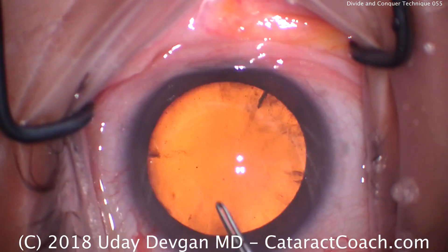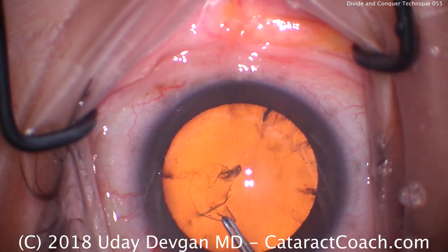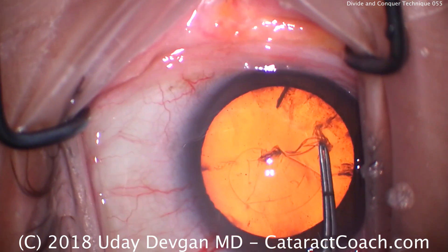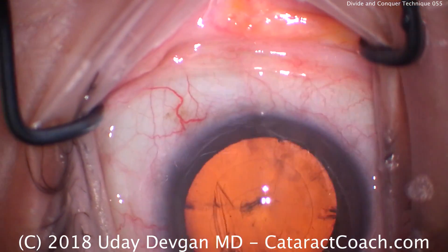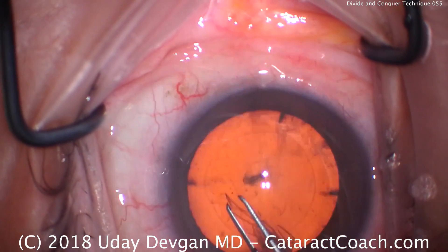For divide and conquer you do want to have a nice intact round capsulorrhexis. There is going to be a little stress on the capsule back when we divide the nucleus into halves and then quadrants — there is that outward push on the capsule. We want an intact rhexis because that circle is strong and it won't rip outwards.